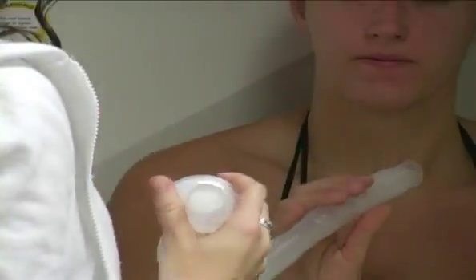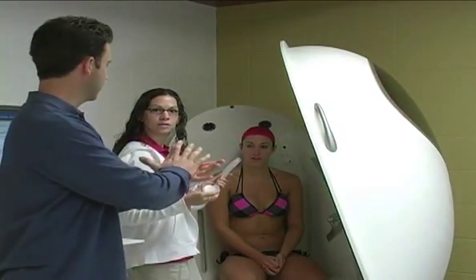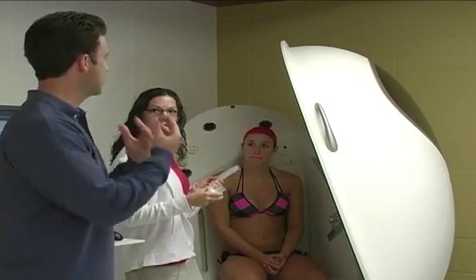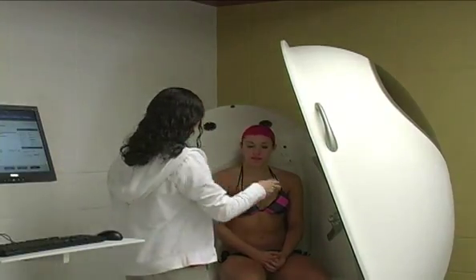So you can feel that it's a little bit different than if you're just breathing normally. She was simulating what the BOD pod's going to do, so her hand going over the end of the filter. The BOD pod will occlude the valve with the shutter, and so therefore there will be resistance. We want you to huff against that resistance. Feel comfortable already? Yep. Okay.